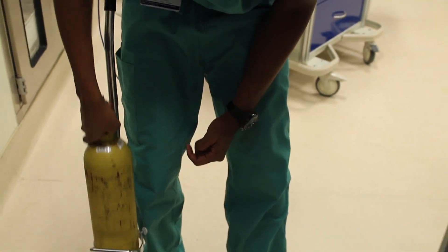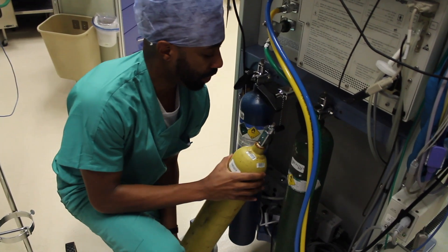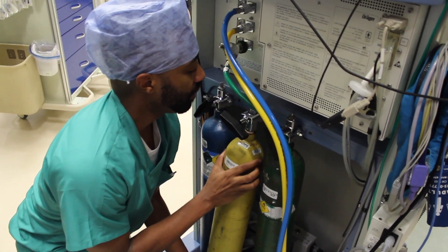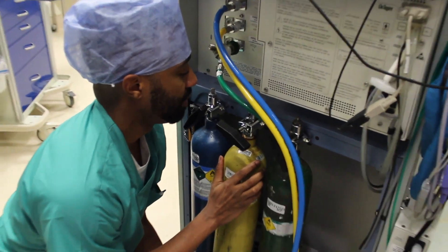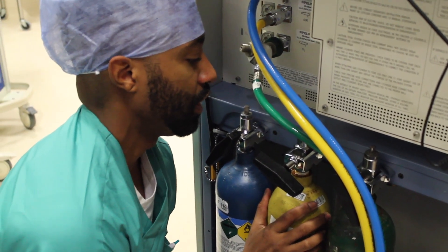We're going to line that up with the proper location — the proper hanger yoke on the back of the anesthesia machine. Here you should snap it in place like so.